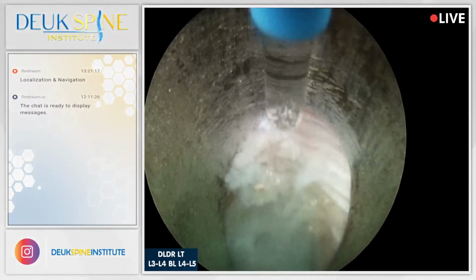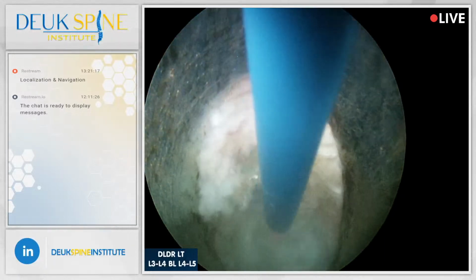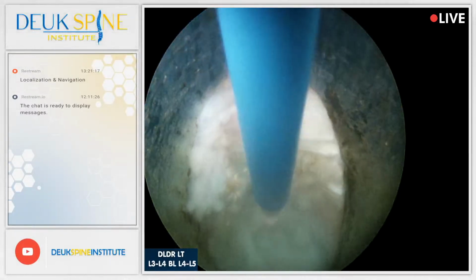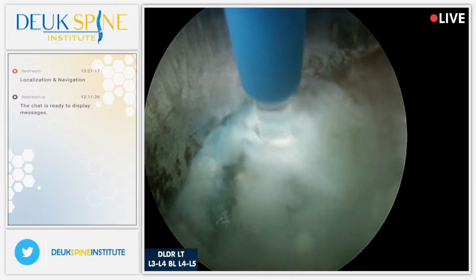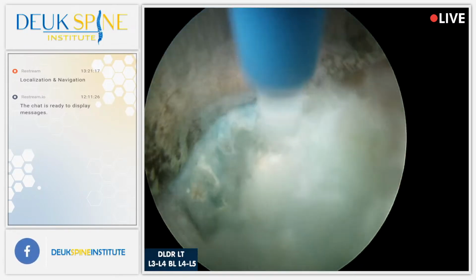Now look at this pink stuff. This is inflammatory tissue that we talk about at the back of the disc in the superficial most part of the annular tear that causes all the pain because the pain fibers are here. The blue stuff is the herniated disc we talked about earlier, the interposed nuclear herniation.